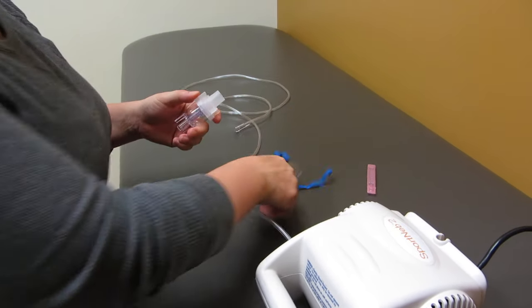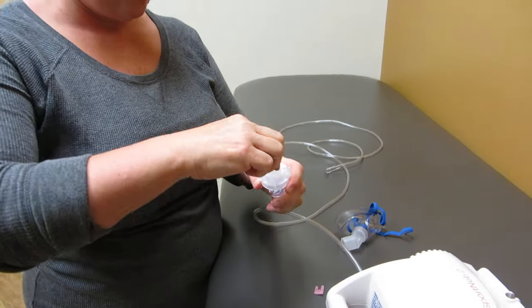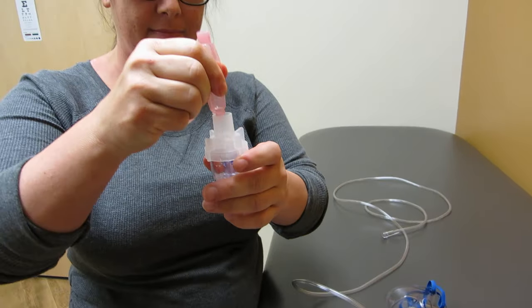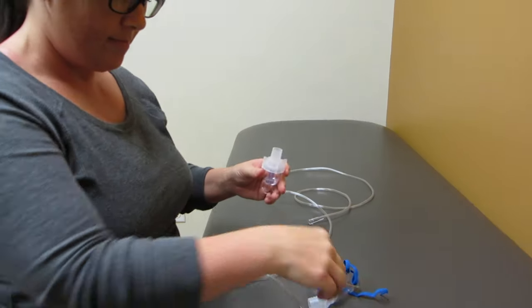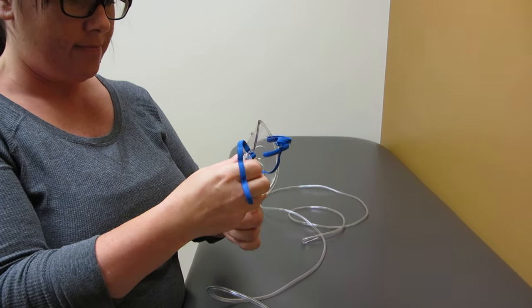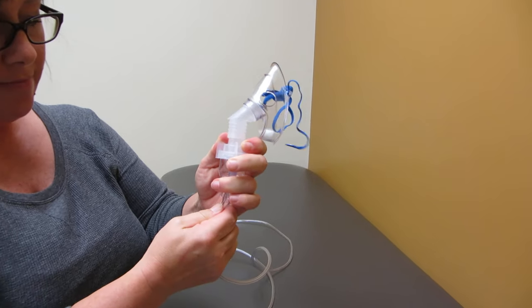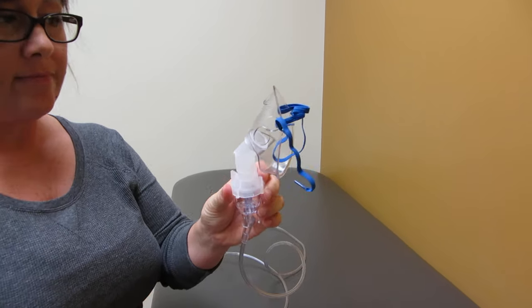We've already plugged it in prior to using it. Now she is taking the medicine. We're going to use saline for this, but you would be using your standard nebulizer medicine, whatever you have been prescribed. She is hooking the mask up to that. Then she is hooking the tubing to it. She does this all before she turns it on.